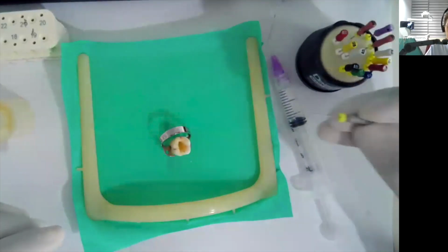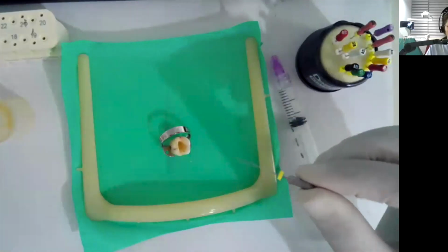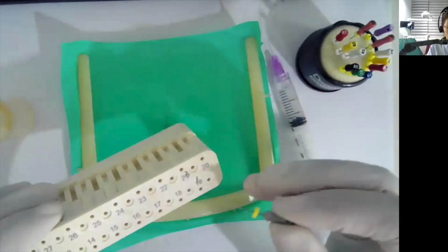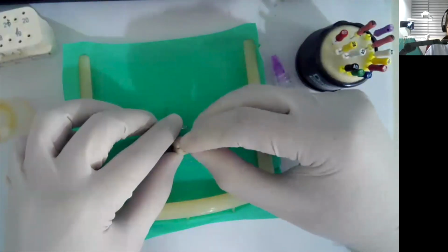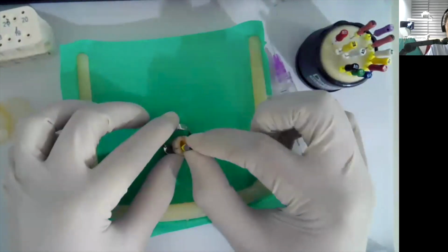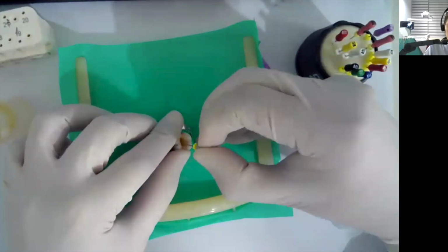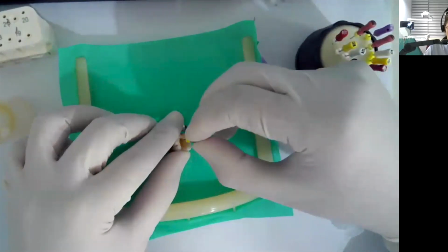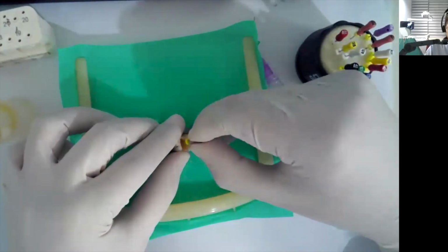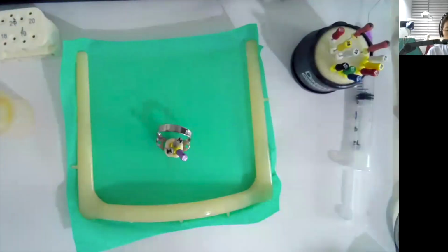I'll try to use size 8 now. I'm using glide finder. So I'm going to measure this at 22.5. Okay. Now it's reaching my reference point and it has a resistance. And I will do the same thing on the mesiolingual. And now I'm going to put it on the distal. Since it's now reaching my reference point, I will take a radiograph. Okay, I have taken my working length, my IAF selection as well.